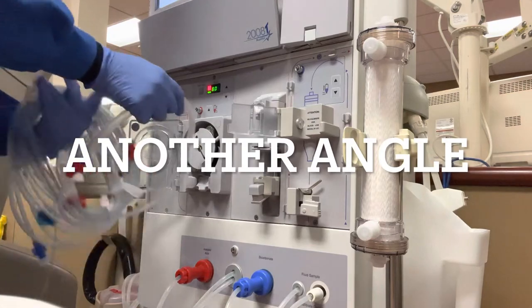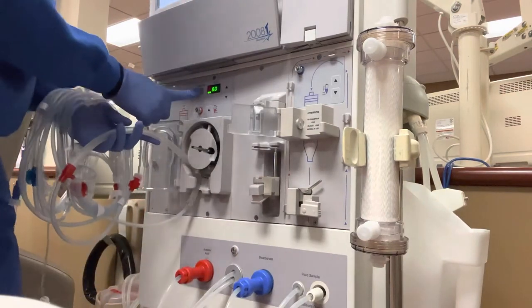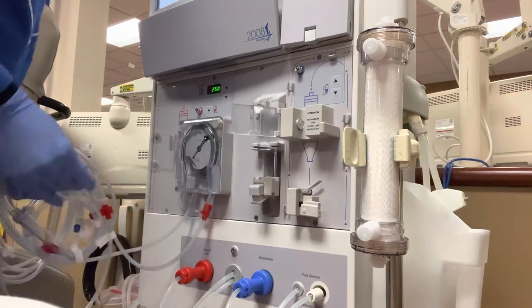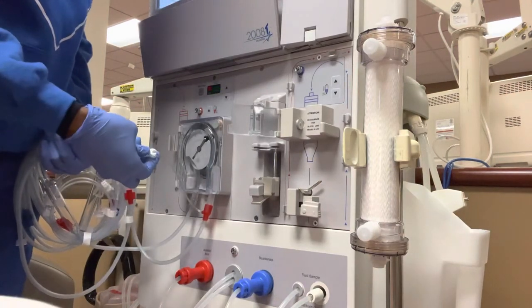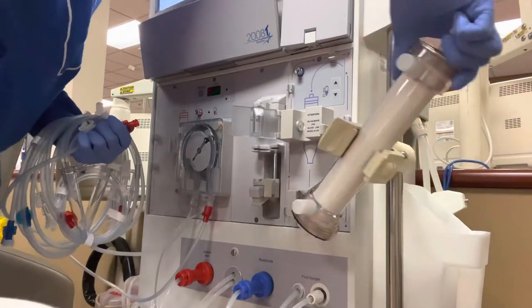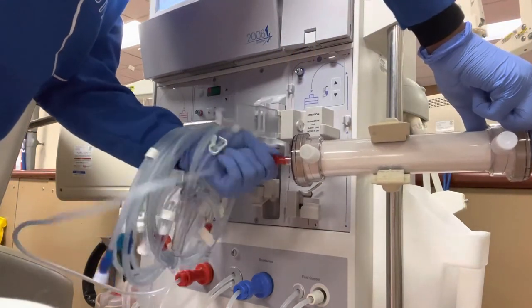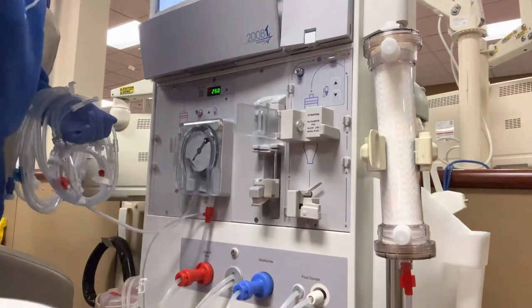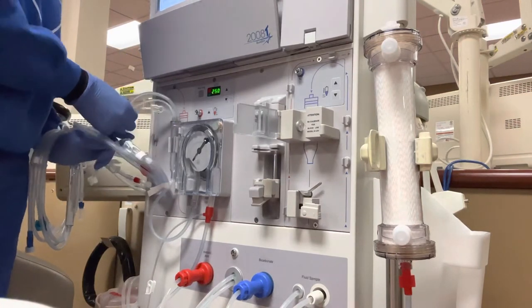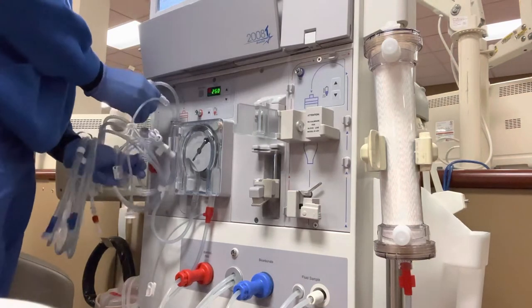And here I give you guys another angle, closer to the dialyzer, closer to my saline bucket, on the venous side, because the other two were on the arterial side, just so you can see all angles as best as I can, because I am the camera woman. I wanted to give y'all another angle just so you can see what it looks like on the other side as well, in case you feel like you missed something. You might be able to see it better at this angle. So I hope that this video has really helped you guys learn what to clamp and how to clamp and where to clamp. As you see, I'm holding the transducer line for my arterial chamber.